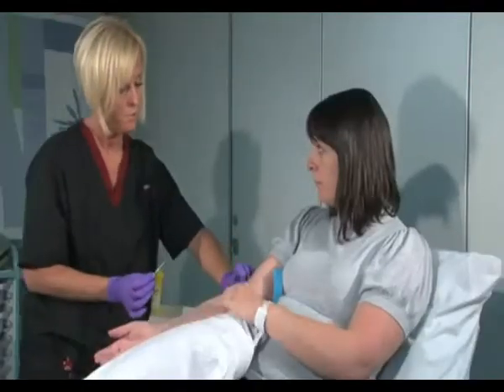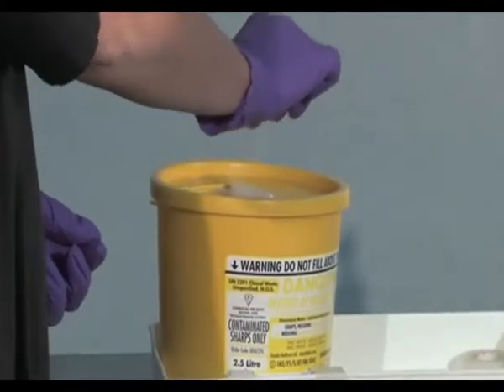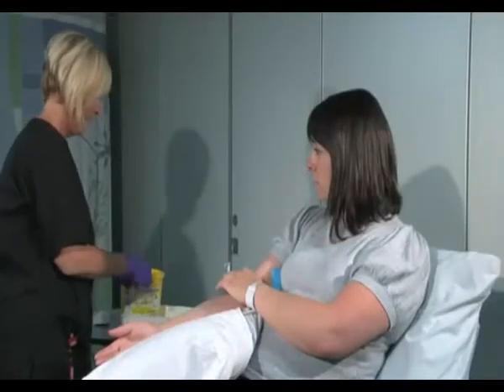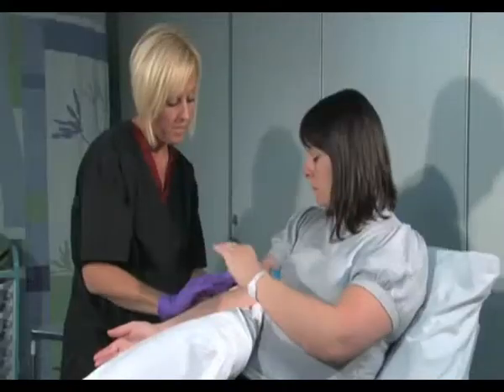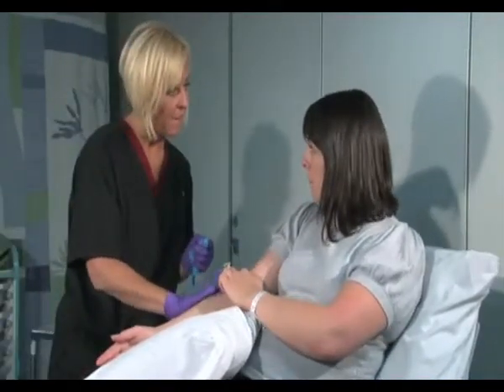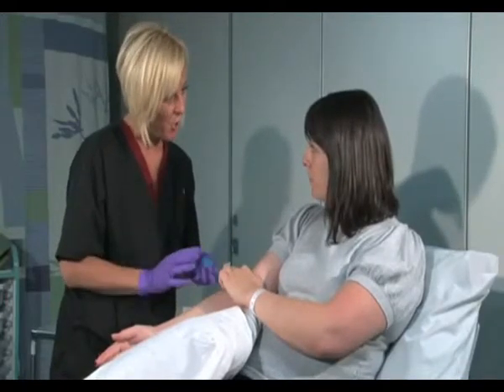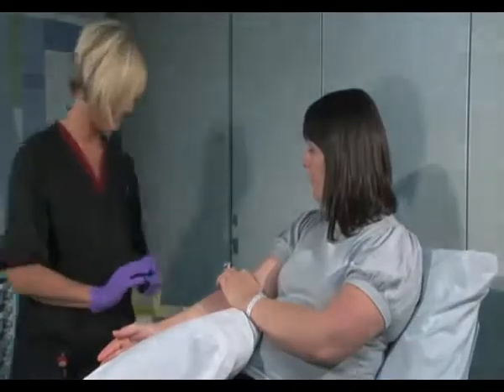And that's all done. Just pop pressure on there for me for just one minute. Pop a little bit of tape on there, and if you just keep pressure on there for a couple of minutes until it stops bleeding, all right? I'm going to send these bloods off to the lab now, and when we get the results I'll let you know. Do you feel okay? I'm fine, thank you. Thank you very much.